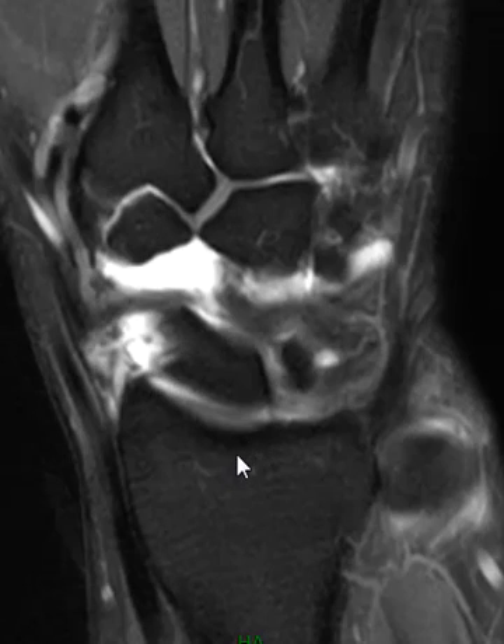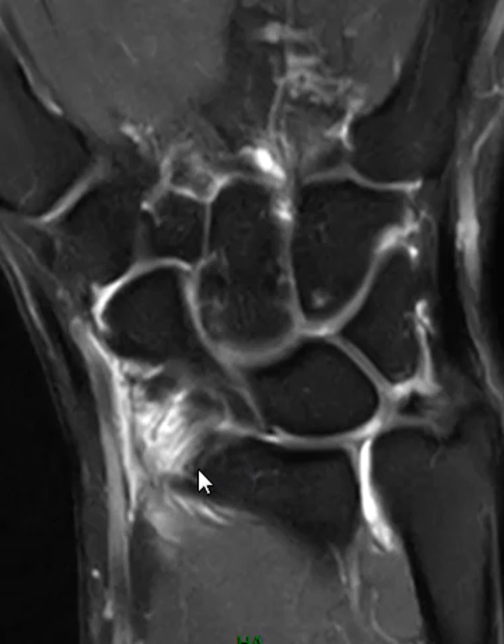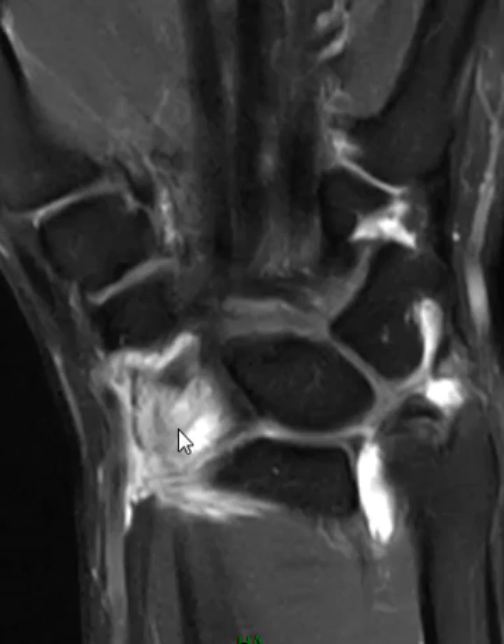I've mentioned it many times in reports that it's intact, and then finally stopped mentioning it because I never saw it injured. But today I see this injured, so it's worthwhile showing. It comes off the radial styloid here — usually a dark black band — but this one's very foggy and ill-defined.